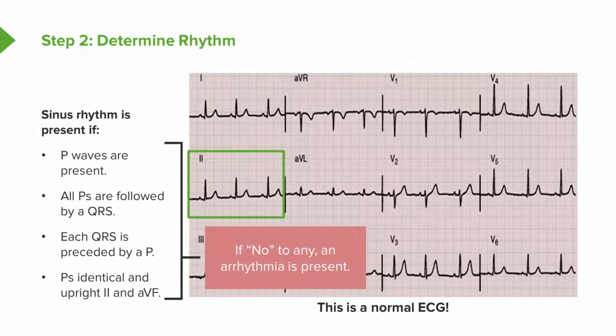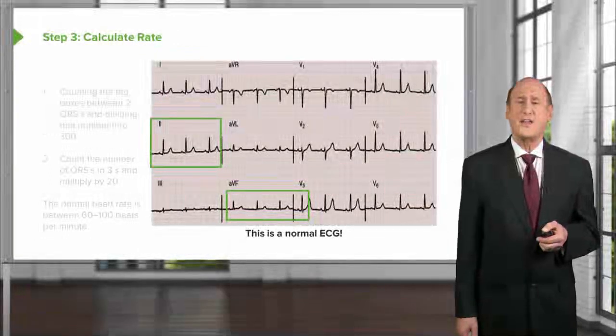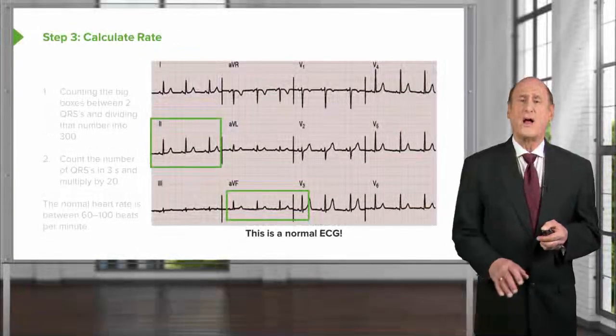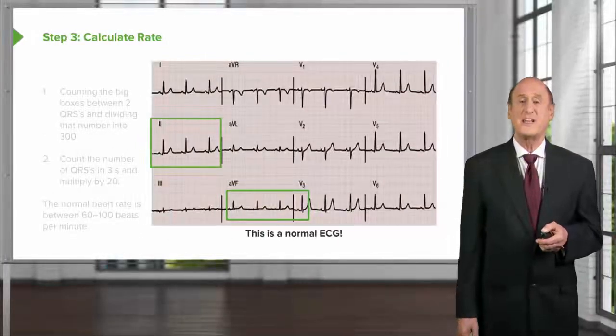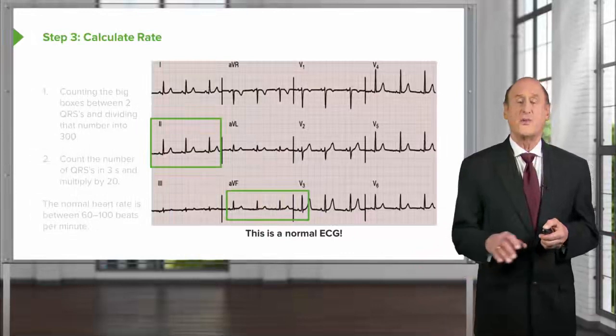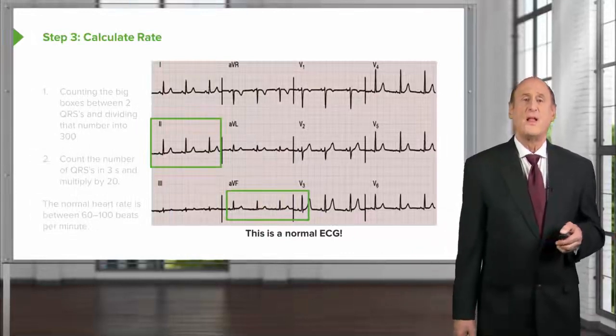And as I said, we're going to have whole lectures on the arrhythmias later. So right now we're just worrying about the normal. Also, you notice how nicely the QRSs progress. In fact, that whole strip along the bottom, even though they're different leads, is continuous. So you're actually seeing one set of P waves after another.